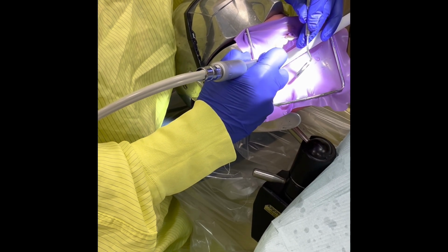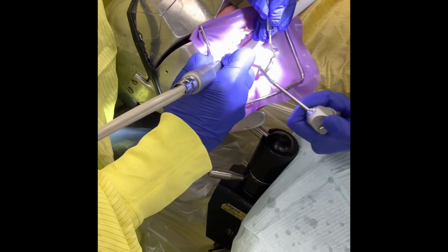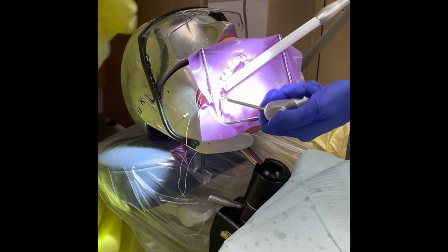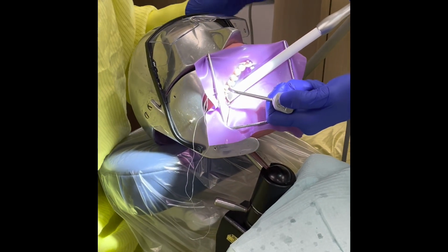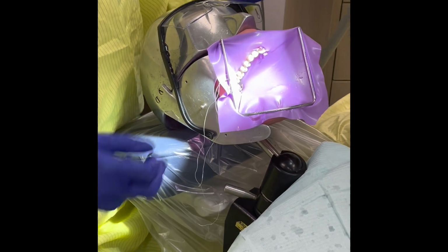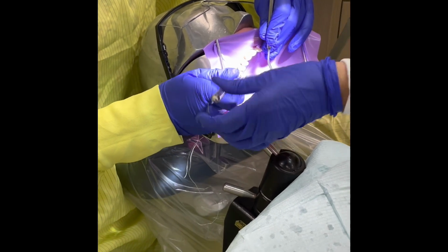Occasionally, you may need to check your operator's mirror if you see there's debris coming onto their mirror. Okay, and you can wash and dry, please. I will take my explorer. Thank you.